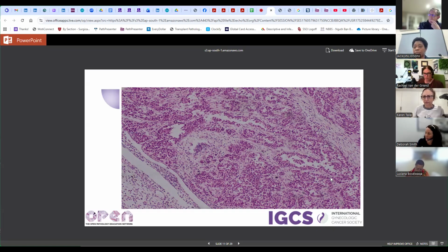Circling back round to the colorectal versus gynae question, my feeling was that she was extremely young. Certainly you can get colorectal in young people, but if you're looking at the stats, that's less likely. And combined with that, the morphology would not favor common colorectal types. It may be possible to look up into the rectum if the clinicians wanted to know. I don't know how much that helps, because if you've got normal mucosa you could feel it was very unlikely to be primary, but if it invades through, you may not be able to tell. But for me, the morphology doesn't fit with any colorectal type that would be particularly common, particularly in a 17-year-old, given that you've got all of the germ cells and the other type entities in the background there.